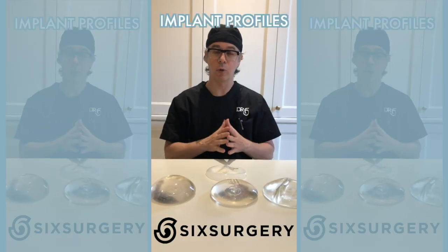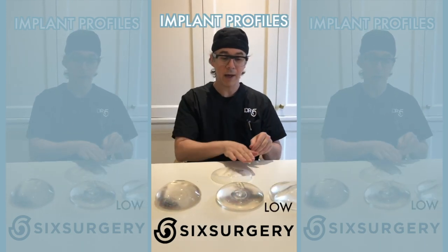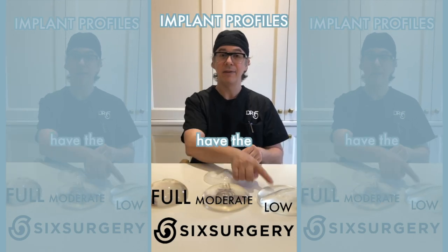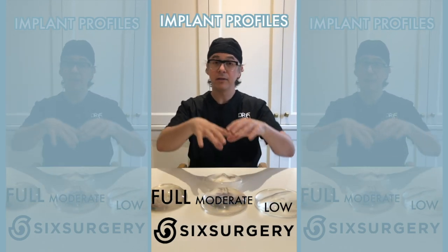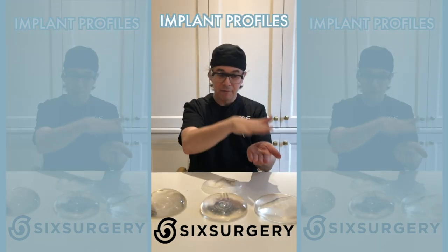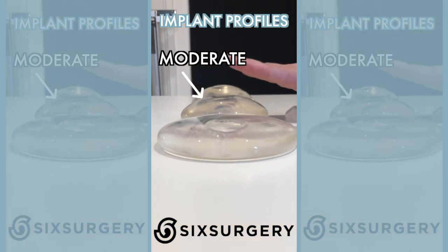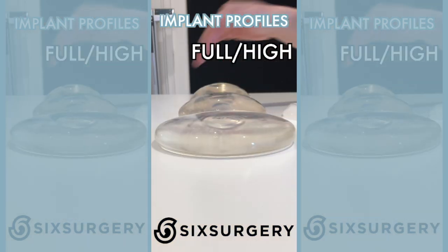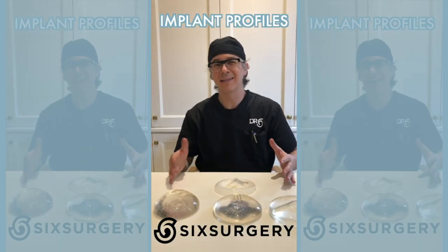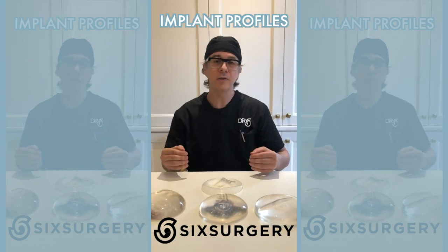Let's talk about profiles — people get confused by them. Here we have a low profile, moderate, and full. These three implants have the exact same volume but in a different configuration. A low profile is a wide, flat implant. A little more narrow and fuller is moderate.